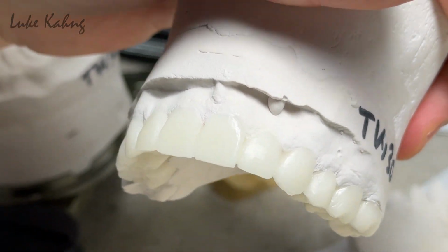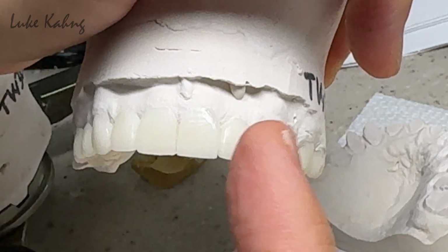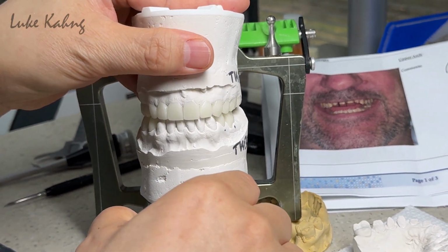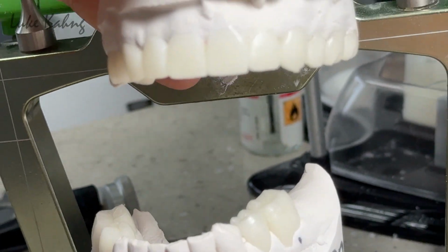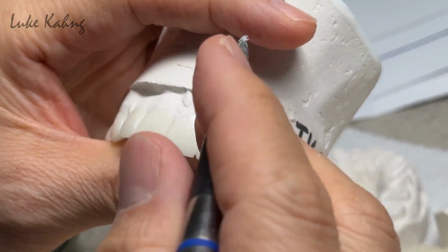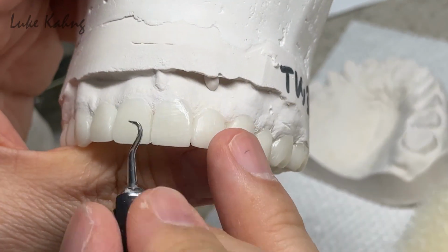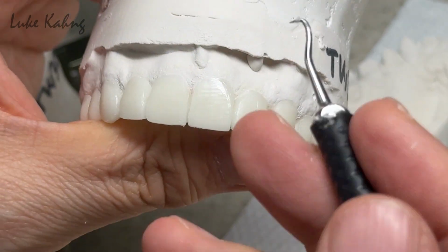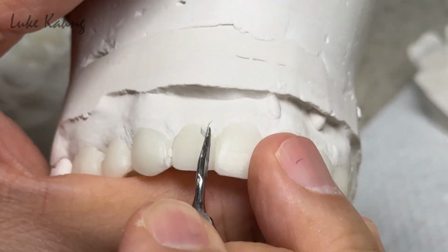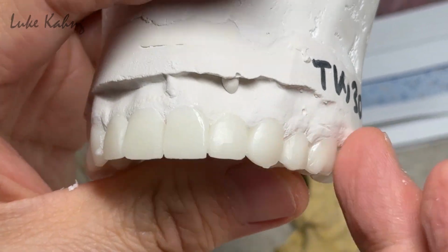And also I'm trying to make the midline correct, but I can't because in that area I have to move more to the other side. So whenever I check this here, the midline is off, and there's not much I can do. Okay, so we'll see. Anyway, that's the concept to the midline. Trying to get a midline, and then I make a nice lobe design and alignment, and then match the same size canine and buccal corridor.